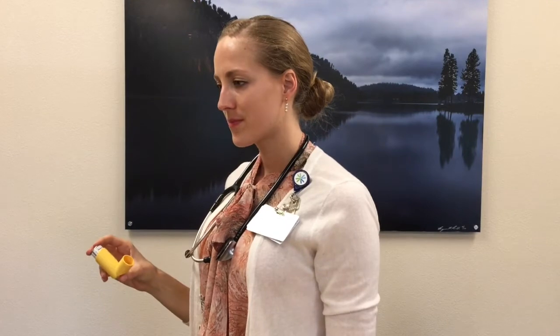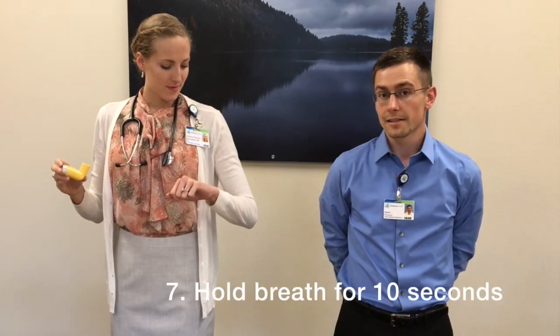If you are using a spacer, then wait five seconds after pressing down on the inhaler before inhaling. Hold your breath for ten seconds if possible. Then, exhale and breathe normally.